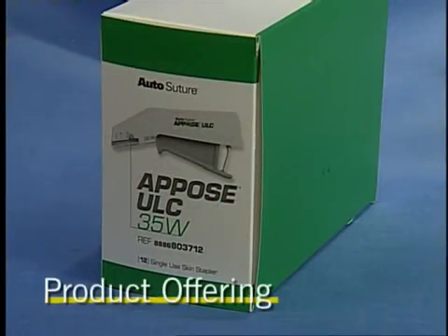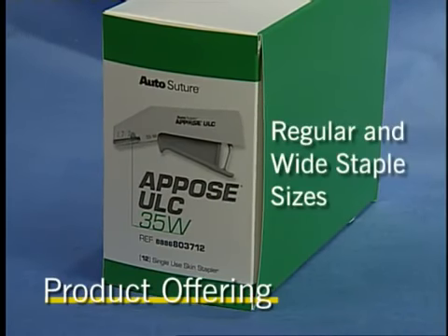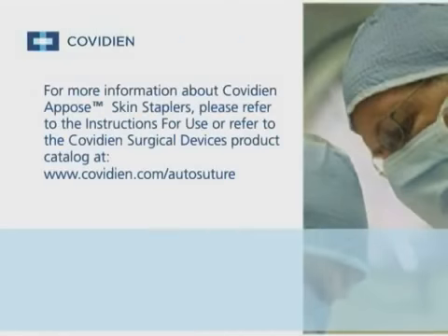The Appose skin staplers are available in two staple widths: regular and wide. The device features an integral counter. For more information about Covidien Appose skin staplers, please refer to the instructions for use, or refer to the Covidien Surgical Devices product catalog at www.covidien.com/autosuture.